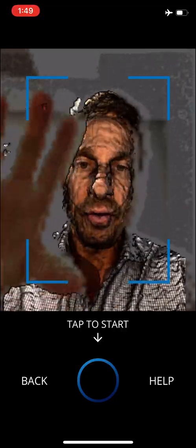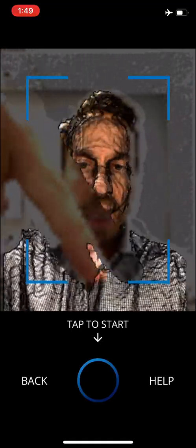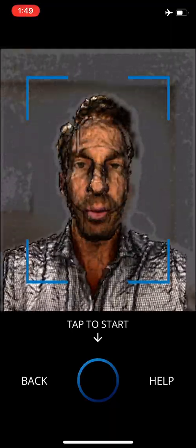You have this fuzzy field right here. I'm going to hold really still and push the 'tap to start' button, wait one second and then stop it. Here we go — I'm going to hold still and not move.